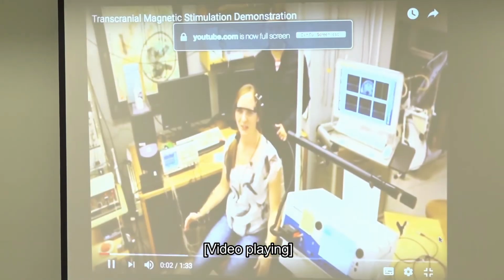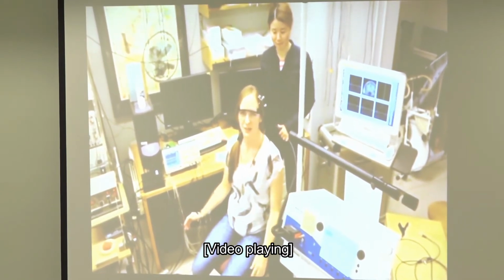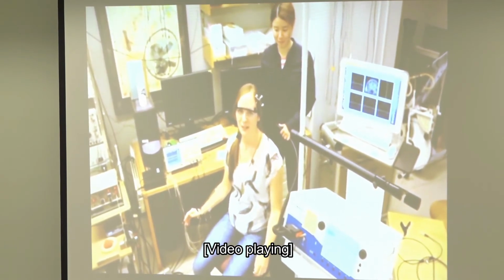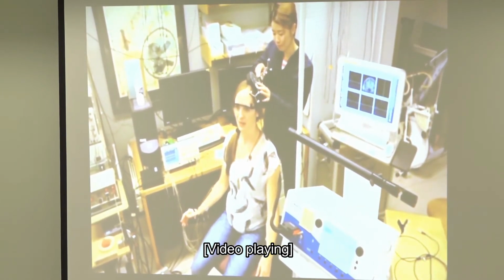Welcome to our laboratory. Today we're going to show you how the transcranial magnetic stimulator works. So first thing, Yoshi's going to put the magnetic coil over top of the area of my motor cortex that's responsible for the muscles of my hand and forearm. Once she's there, she's going to deliver a magnetic pulse.